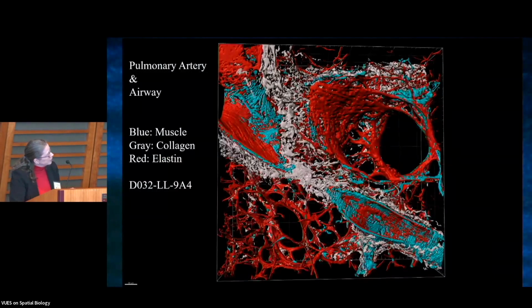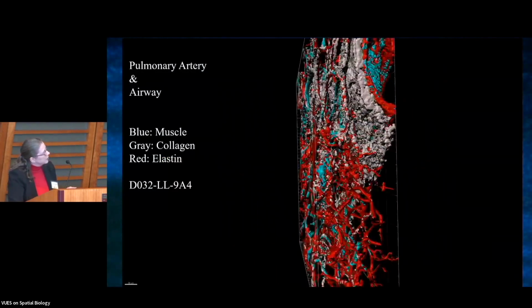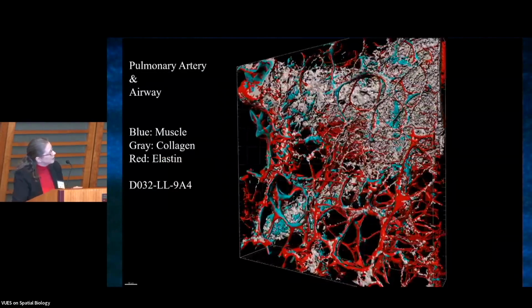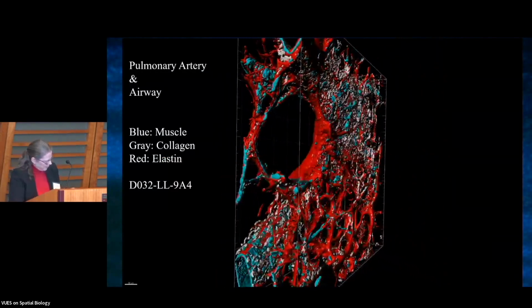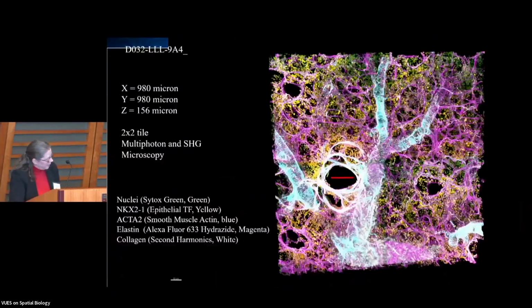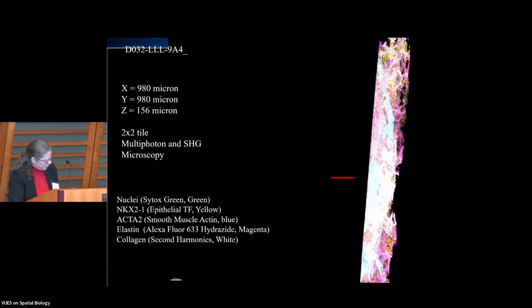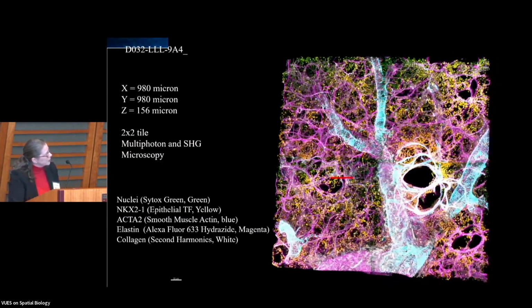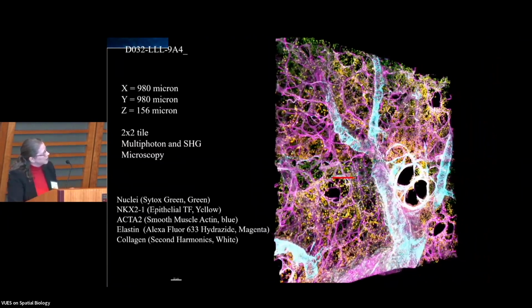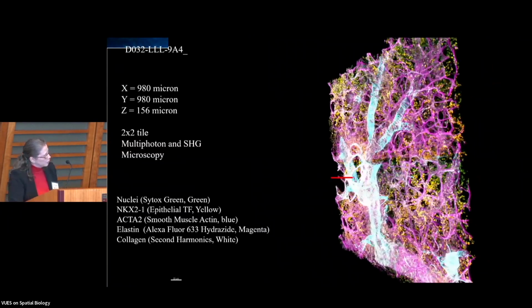Here, we're looking just at the connective tissue without the cellularity. I would love to be able to see the epithelial cells as it lies on that extracellular matrix, as well as the blood vessels running through them. And in this view, where certain types of nuclei are stained, we can start to understand the cellular composition of those structures, all on the same image data set. But depending on how you display that data and allow us to interact with it, we make different observations and new hypotheses.